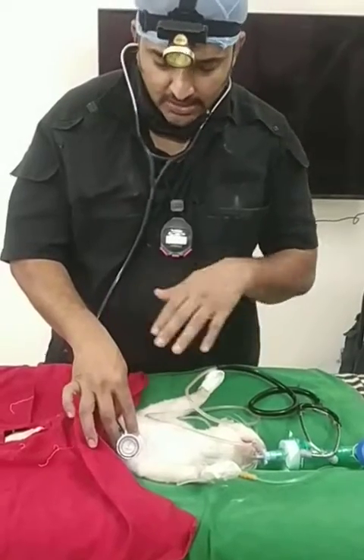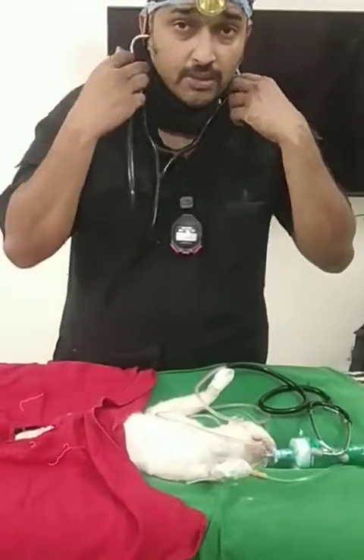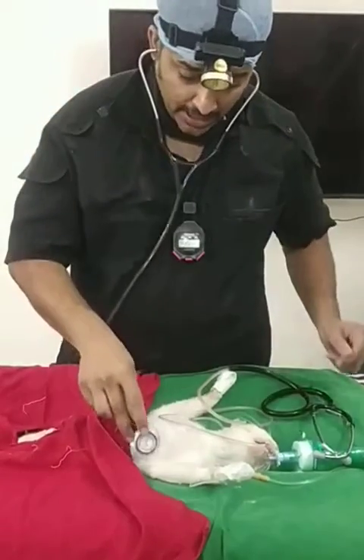This is a very important demonstration. This cat has undergone a spay procedure — she's on gas anesthesia at the moment. I have a proper cardiac stethoscope here and I'm auscultating to assess heart sounds.